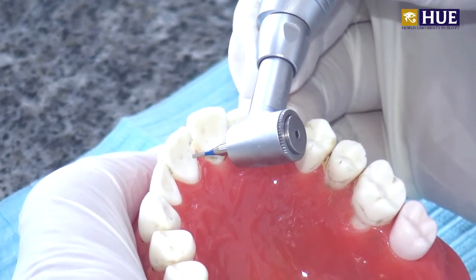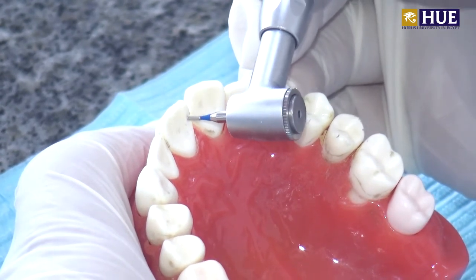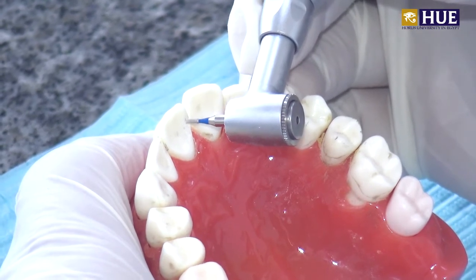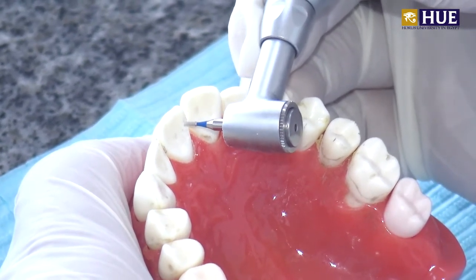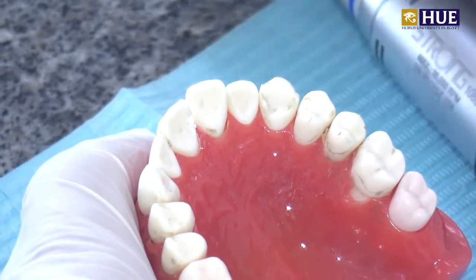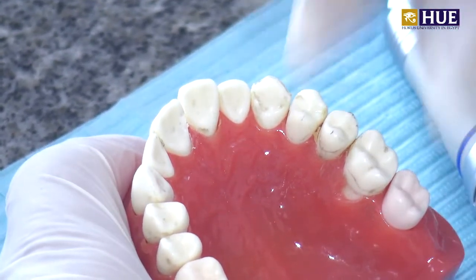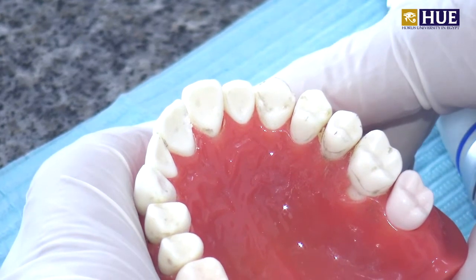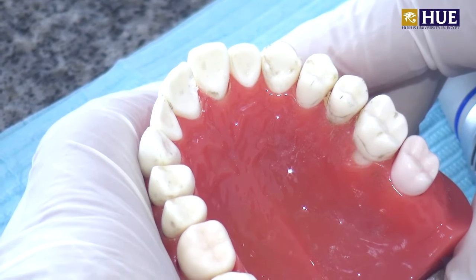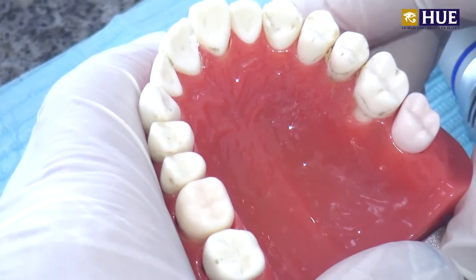This is in a large cavity for enhancement of retention in case of amalgam restoration. I mentioned this is only for amalgam restorations, for the purpose of retention, while for composite resin restorations we don't need to perform these grooves. The retention will be completely provided by bonding agents or adhesives.